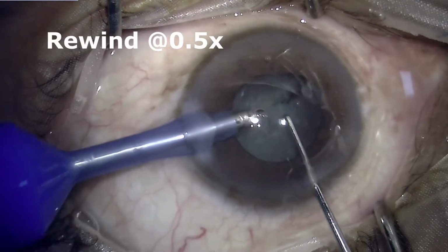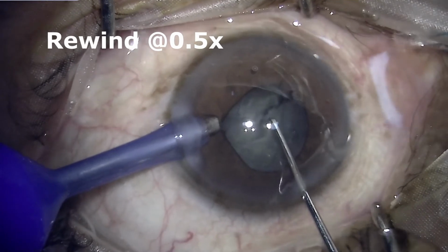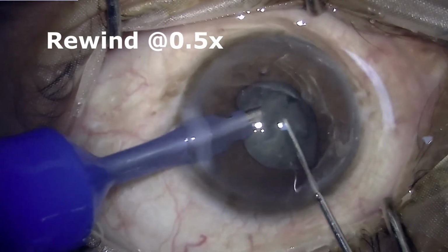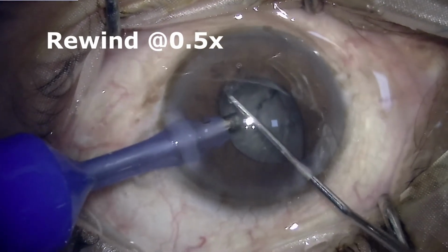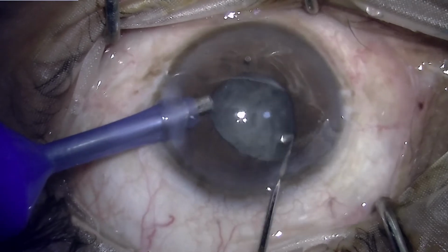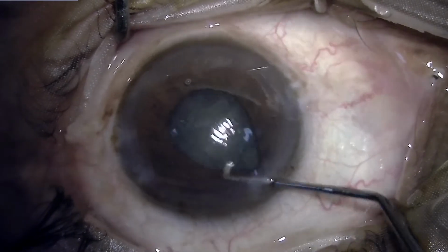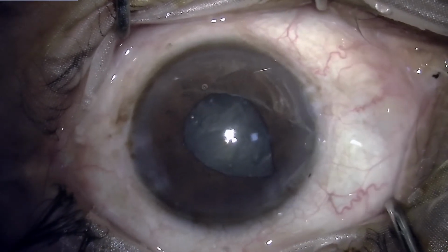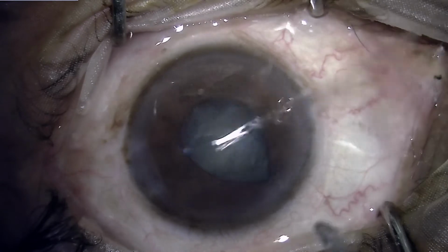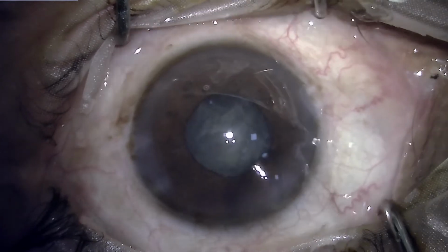when this happens. So this is a fluttering, the pupil constricts and it comes into the zone where the fluid is being aspirated, although no power was applied, but still the iris was caught in the phaco tip. Now in a situation like this, the iris gets traumatized and there is a release of prostaglandins which further enhances the pupillary miosis. So it's a situation where it gets difficult as the time goes by. We can see now the iris is getting prolapsed out of the side port also, and repositioning it is a task now, and the pupil is reasonably small.